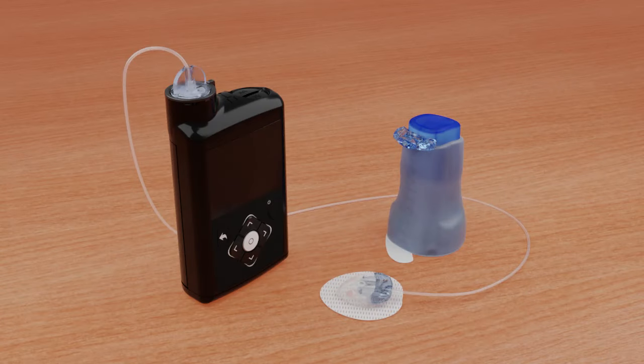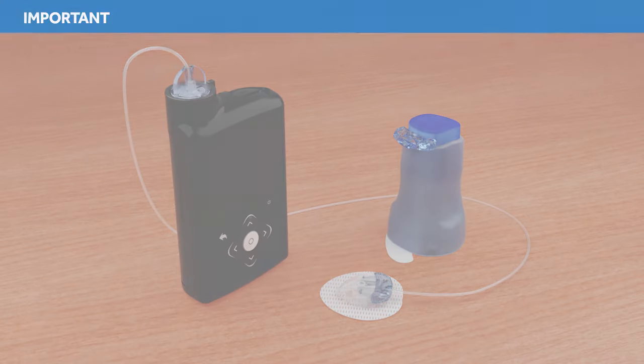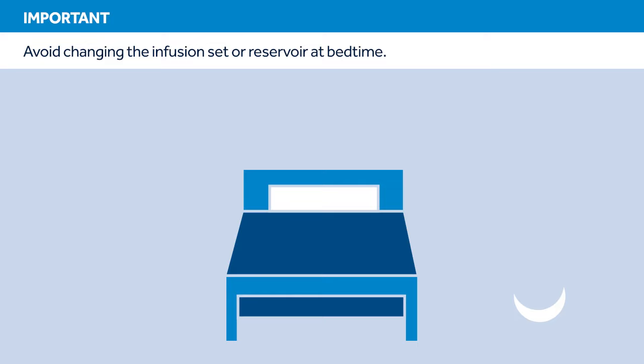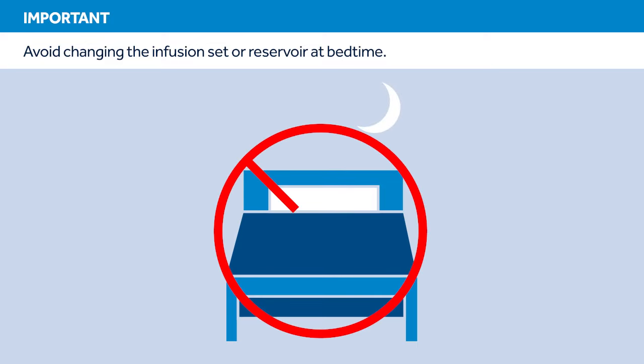In this video, we'll show you how to insert the Medtronic Extended Infusion Set. We will also go over how to change out only the reservoir during the 7-day wear of the Medtronic Extended Infusion Set as needed. It is important that you follow the instructions as they are shown in this training. Refer to the Quick Reference Guide for instructions specific to your pump model on rewinding and filling the tubing and cannula. Try to avoid changing your infusion set or reservoir before bedtime unless you're able to check your blood glucose 1-3 hours after the change.